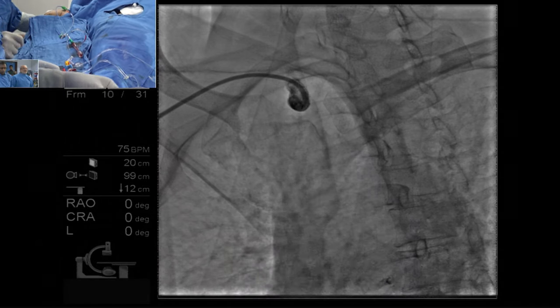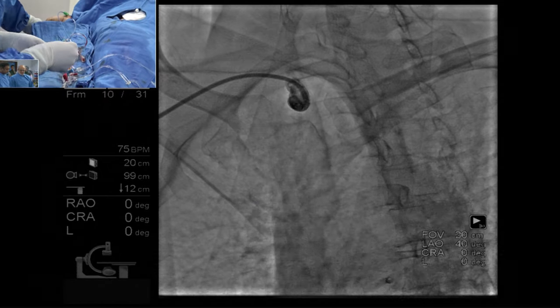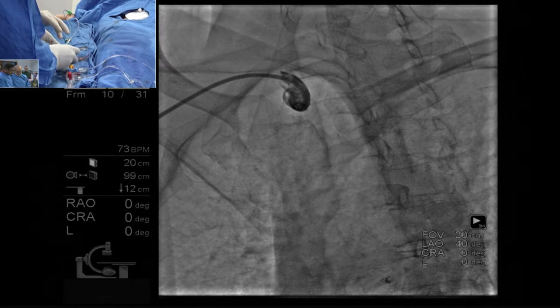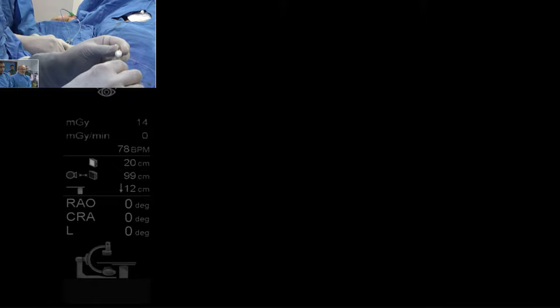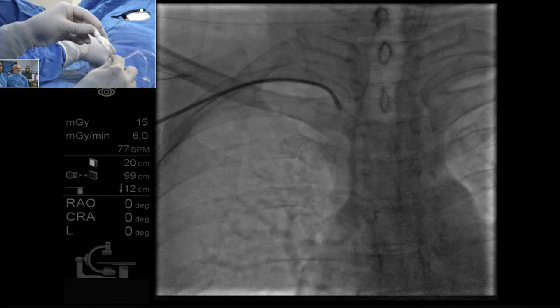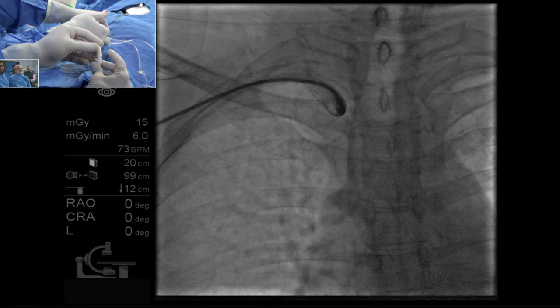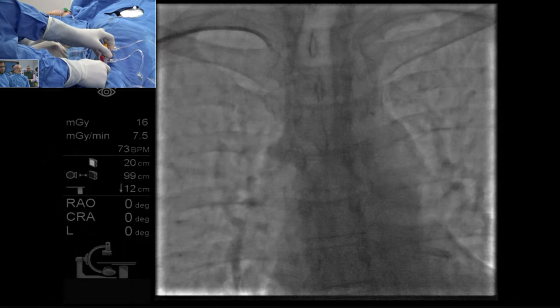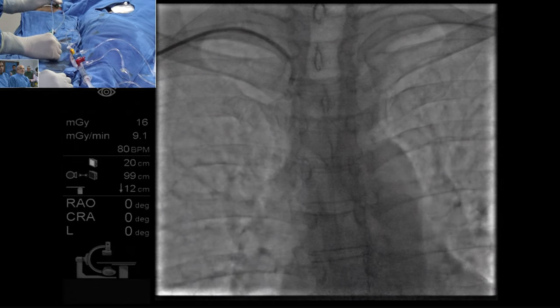Give me quickly. Sort of looks like a complex angle. The vessels look fairly smooth up there overall. Probably it's an angle, yes. I am through. See, it's not going.